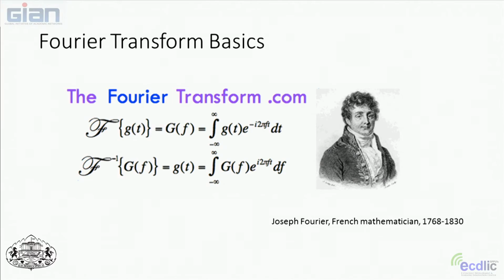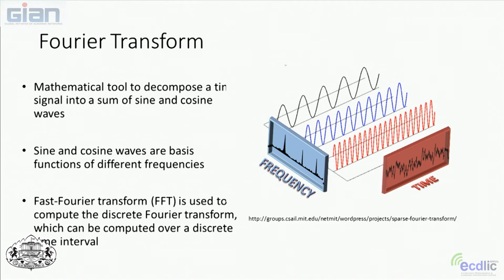So here's the basic Fourier transform. And I don't want any of you to have to memorize this or feel intimidated by it, but it's a very clever tool that we use to get information from time to frequency and vice versa. And you'll see again when we start doing MRIs that we use a two-dimensional spatial Fourier transform to get the brain images that we measure. So this is sort of a visual description of how you get from a time domain to a frequency domain.